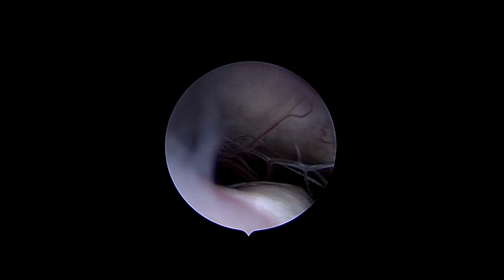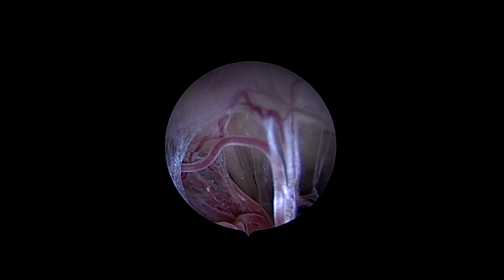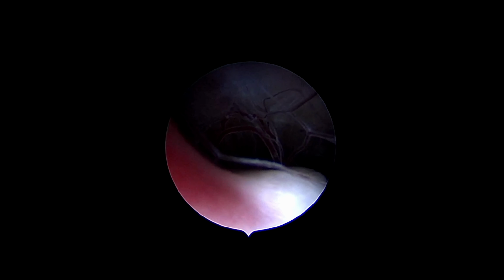The endoscope was moved down in between the basilar artery and the dorsum sellae. One can see the perforator from the basilar artery. Very nice view, and one can also see the sixth nerve through the perforator.